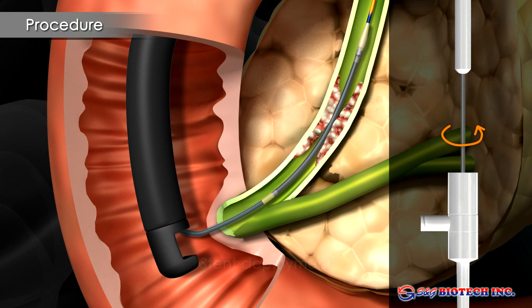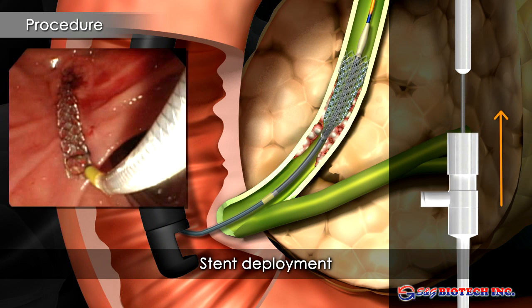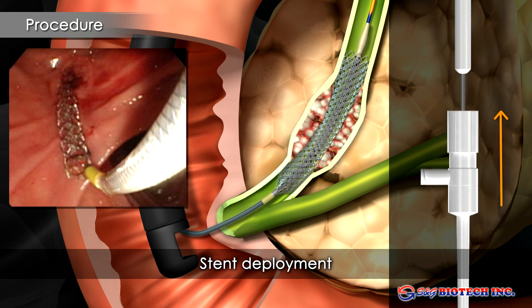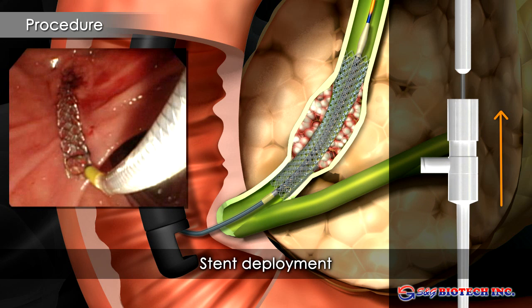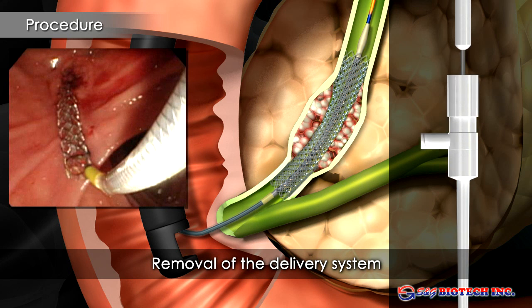The restraining sheet is unlocked and withdrawn slowly, maintaining stent position under real-time fluoroscopic control. After the stent is fully deployed, the delivery system is removed.